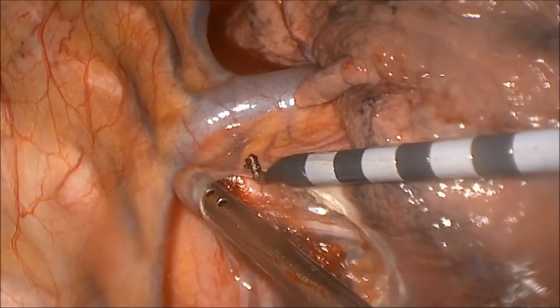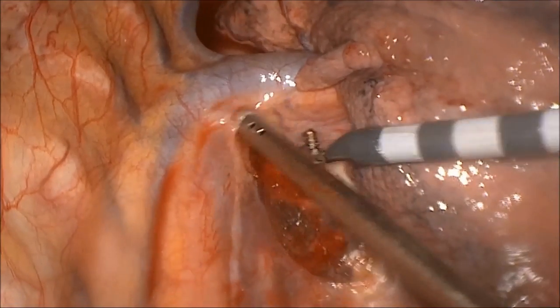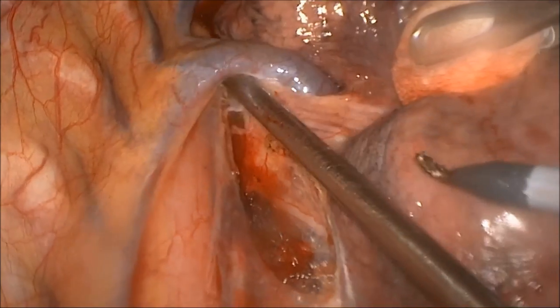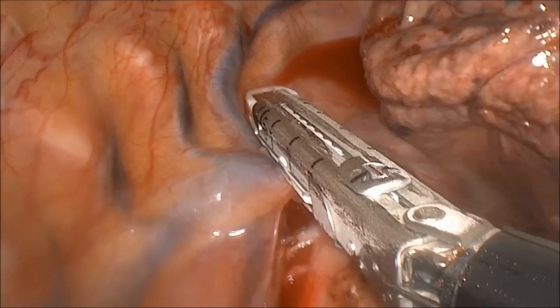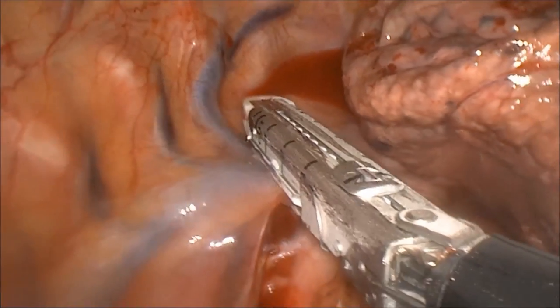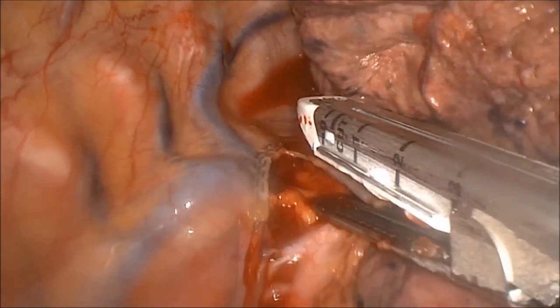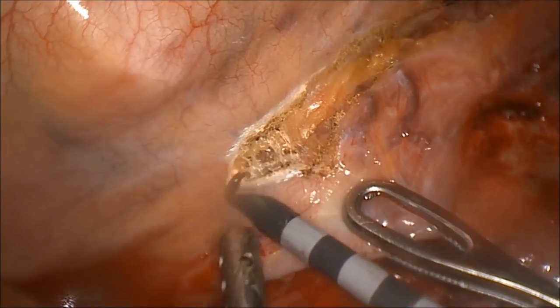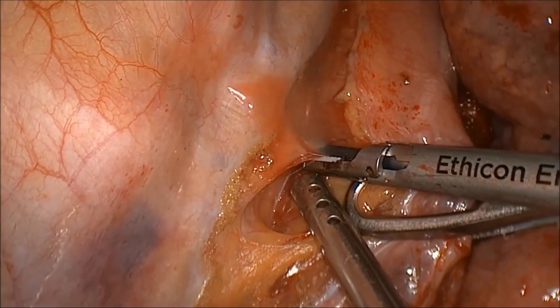Dissection is carried along the posterior hilum, dividing the mediastinal pleura up to the level of the azygous vein. The vein is then circumferentially dissected and divided using the endo-GIA vascular load stapler. The mediastinal pleura is divided from the level of the azygous vein down to the diaphragm, and esophageal perforators from the aorta are divided using a harmonic scalpel.